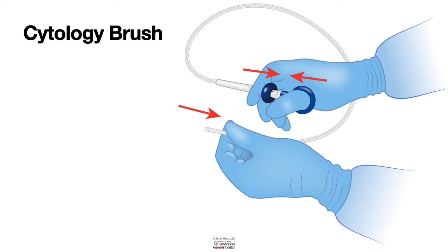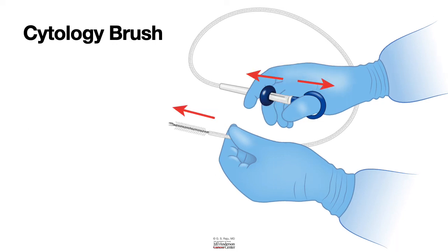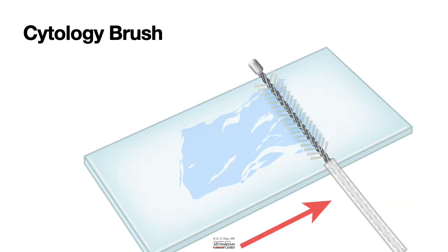And once it's out of the biopsy channel, the next step is to create a smear on a slide. So you open the brush and then take a slide or two and make a smear by moving it from one end to the other end. And this is how we prepare the slides with this cytology brush. And the slides are sent to the pathologist in a special container. Sometimes it may include a preservative for the slides.